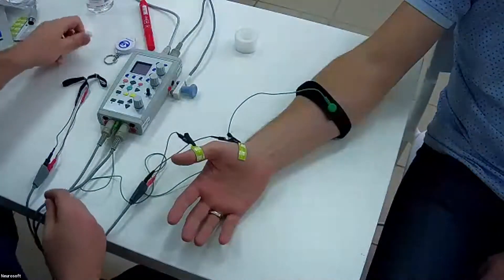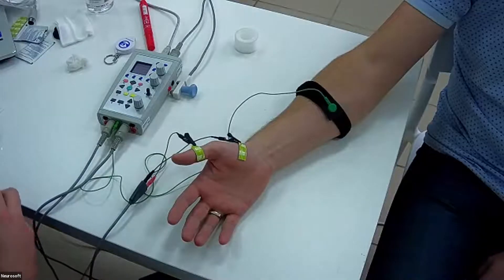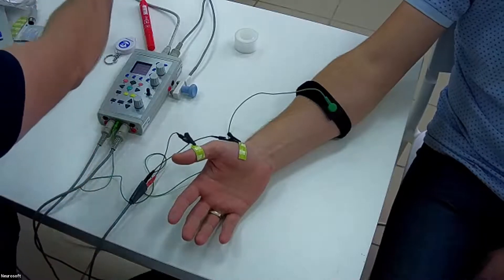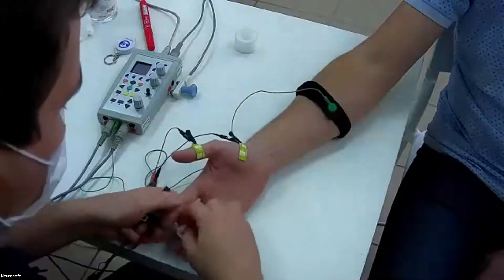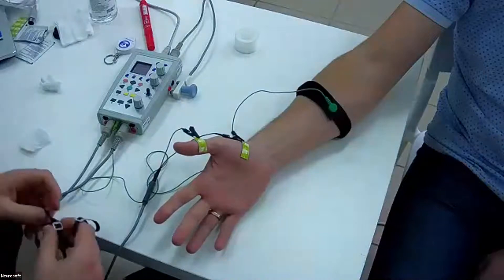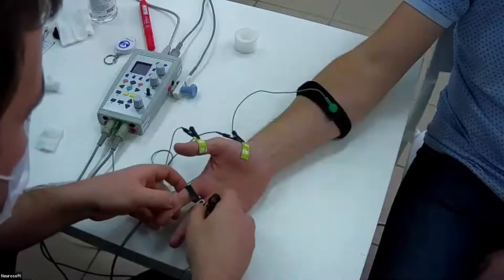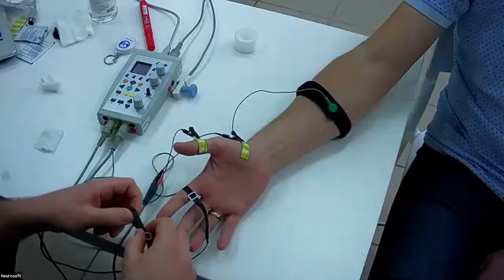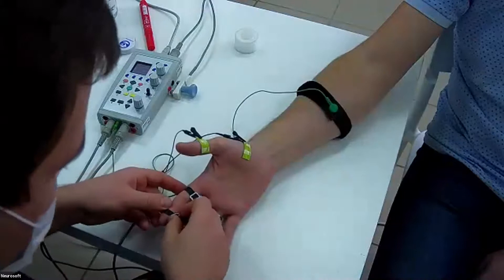It's ergonomic to also set the sensory electrodes. For the median nerve we can use the second or third finger. The active electrode is set at the midway of the proximal phalanx, and the reference electrode is placed about four centimeters distally.